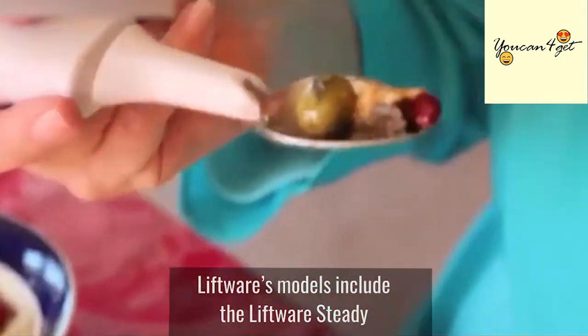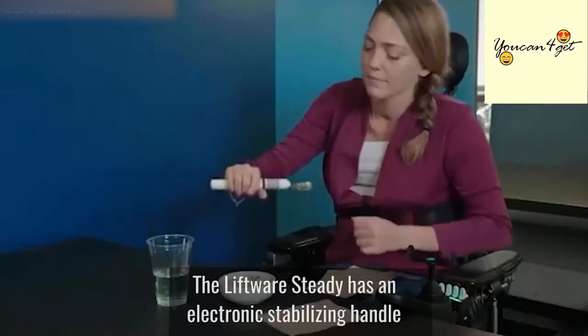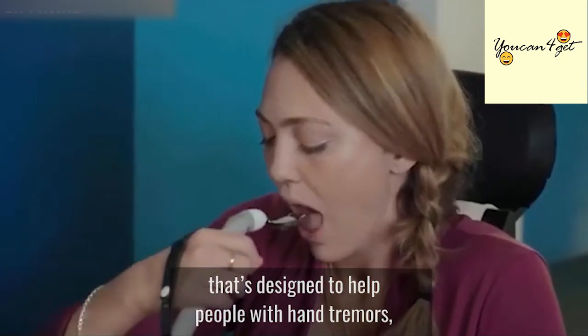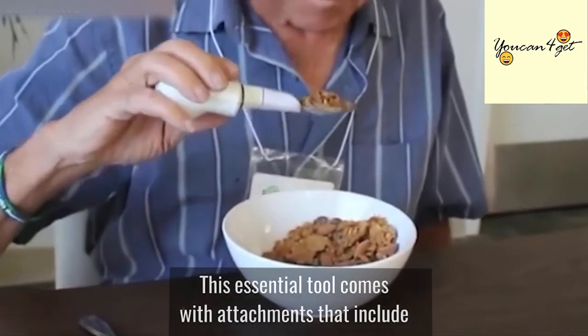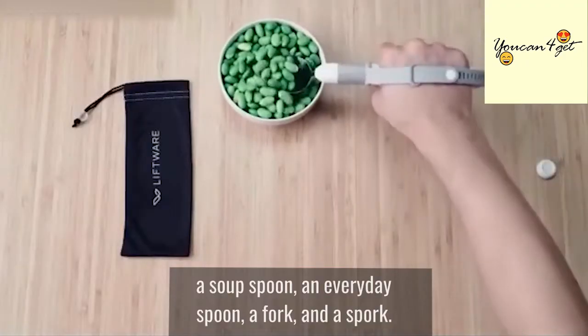Liftware's models include the Liftware Steady and the Liftware Level. The Liftware Steady has an electronic stabilizing handle that's designed to help people with hand tremors which may be related to Parkinson's disease. This essential tool comes with attachments that include a soup spoon, an everyday spoon, a fork and a spork.